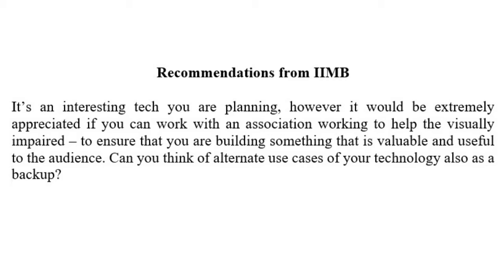To quote a few, negative effects of range in existing smart canes. The error associated with high-range smart canes is of a practical nature. A situation where an output is produced due to an obstacle existing far away from the user may be confused with a nearby object. Obstacles of greater height. The use of a cane aids in detection of obstacles in proximity to the ground. The risk of colliding with an obstacle at a height considerably above ground level is high.